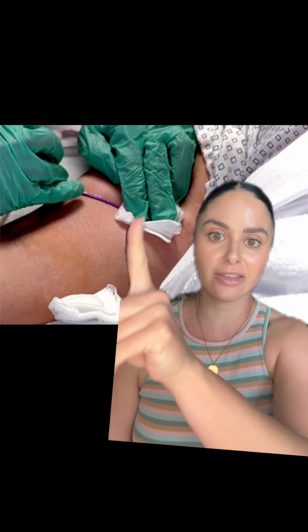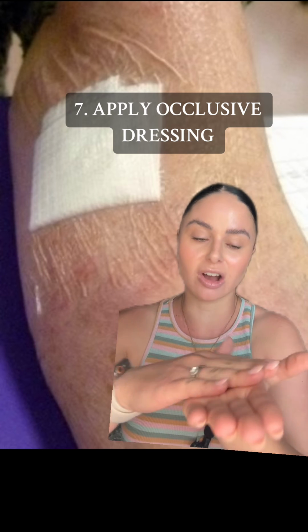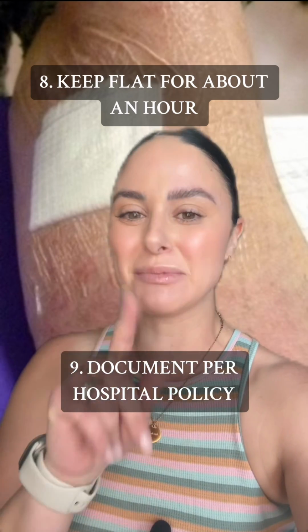If you're culturing your line, then you're going to want to make sure you have a place to put it so it doesn't get dirty. And once the bleeding has stopped, I will put my petroleum dressing on. So again, transparent dressing, sterile gauze, petroleum. So the petroleum is going to be touching the skin. Make sure you get a nice occlusive dressing on the outside, and then keep your patient flat for about an hour. And that's it. Let me know if you have any questions.